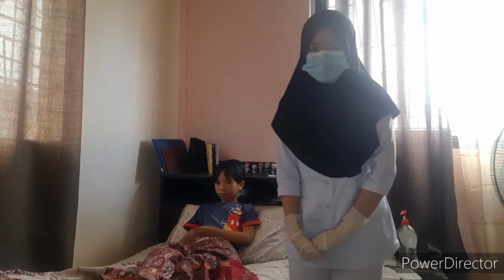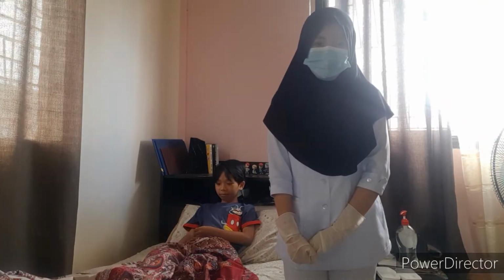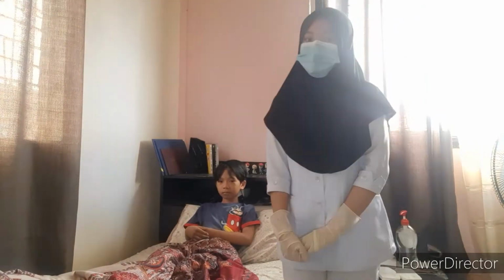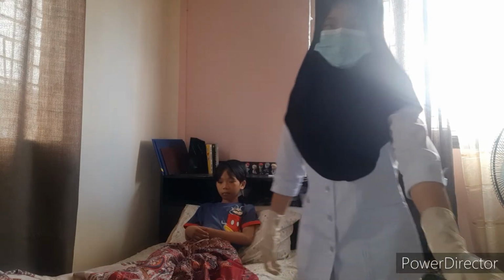So the next one is we have to remove the client's arm and shoulder from one sleeve of the gown or clothes, avoiding exposing the chest. So this is to expose the axilla for correct thermometer placement.